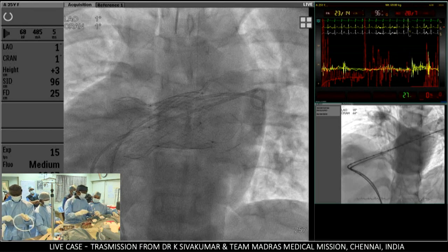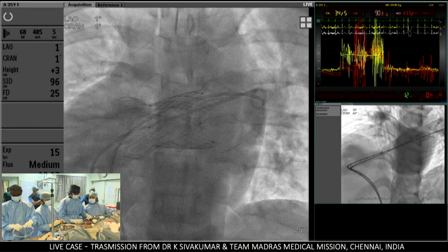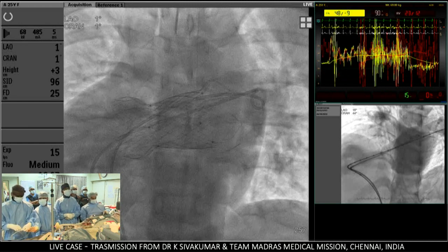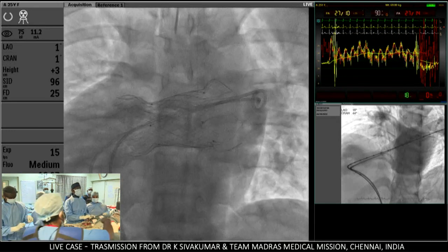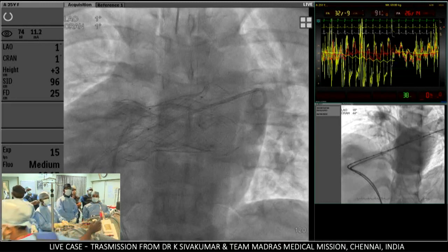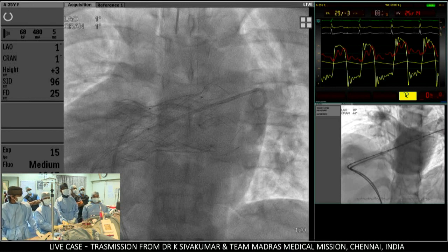Connect both to pressures, 25 scale. So this will be a very beautiful result, something you make look very easy. I hope so. See, now both catheters are in the pulmonary artery. I'm going to withdraw my right coronary artery catheter proximal to the valve. So that is the, increase the speed. So there is a good hold up of the diastolic pressures. Take away the mean pressure from the right ventricle. No mean pressure for right ventricle.